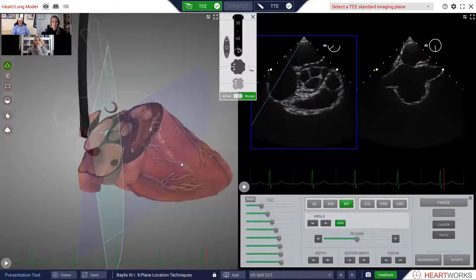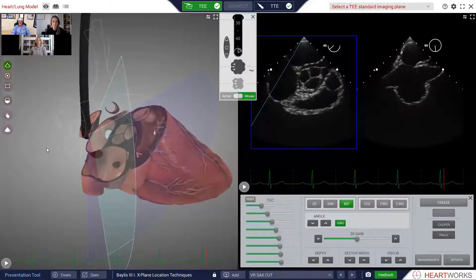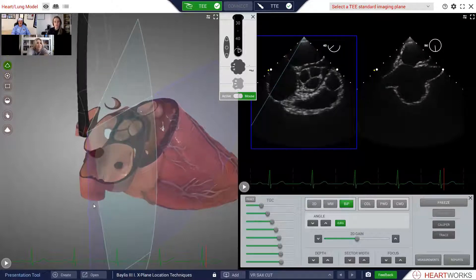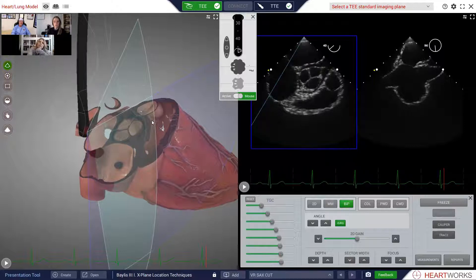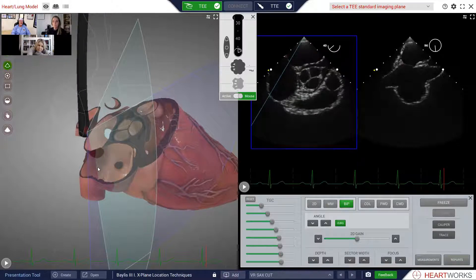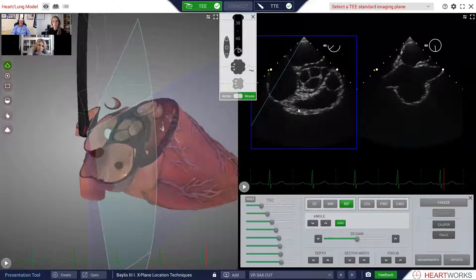Here is the virtual reality of the x-plane, or biplane. The blue screen is shown as a blue sonication plane here, and the mint screen is the mint sonication plane here. This cut through the heart right here, Jody — is that the short axis or the bicaval cut? From the blue? Yes. In other words, I've sectioned this heart using the plane itself. You can see that this cut through the heart looks exactly like the actual short axis view being generated from that cut plane.